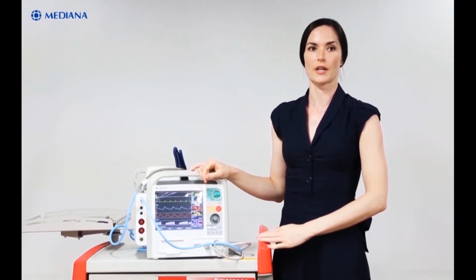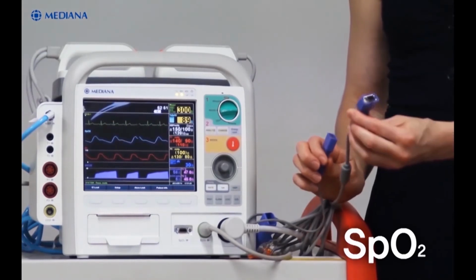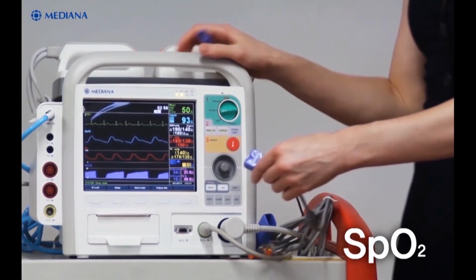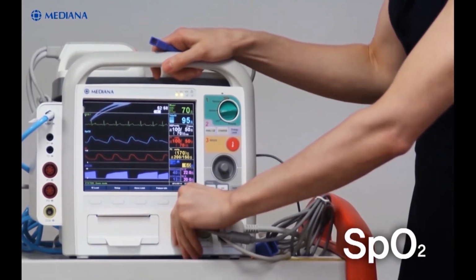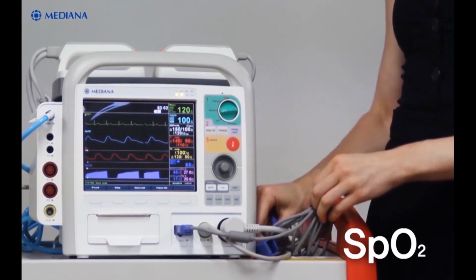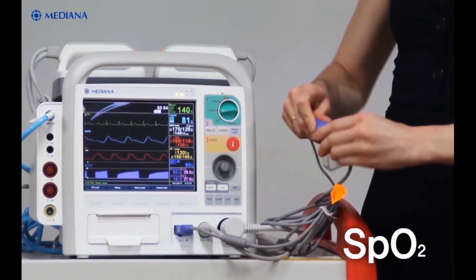Last, you can attach the cuff to the end of the hose. For SpO2 use, we need the SpO2 cable and sensor. First, select an appropriate sensor for the patient and desired application, and then connect the extension cable to the SpO2 connector on the D500's front panel, and finally attach the sensor to the end of the cable.